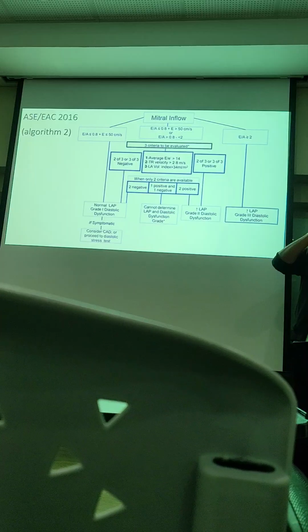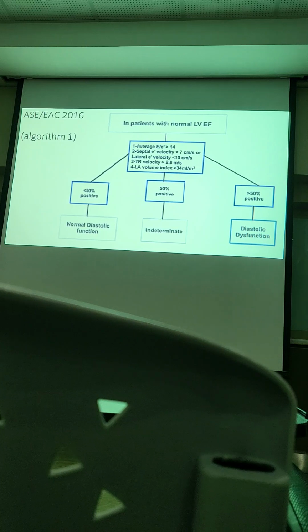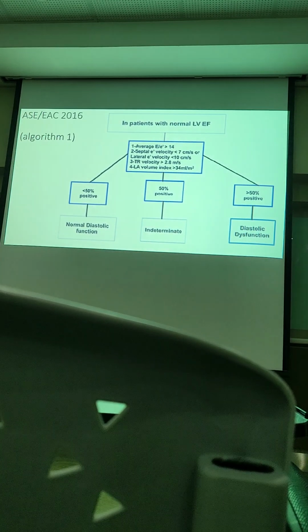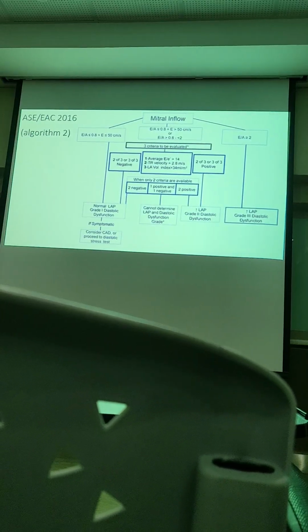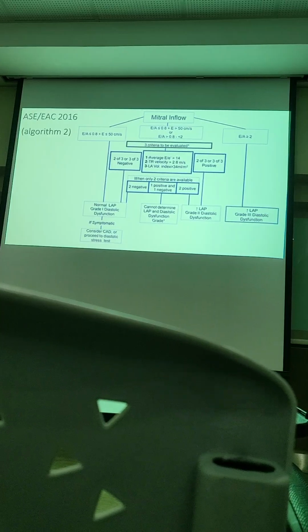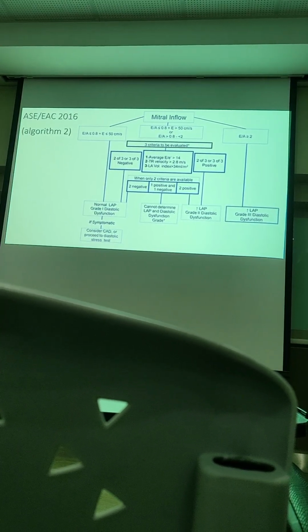Okay. Kalau perasan, the parameters mentioned in both of these algorithms are actually more or less the same. E over E prime, septal E prime, lateral E prime, velocity, lagi, sama juga dengan sini. So, kenapa these parameters are important is because these parameters signify the LA pressure. Okay.